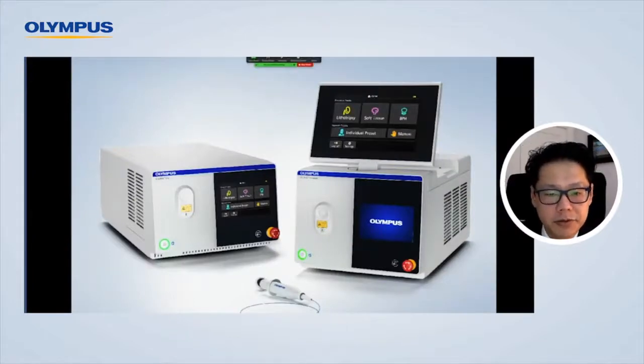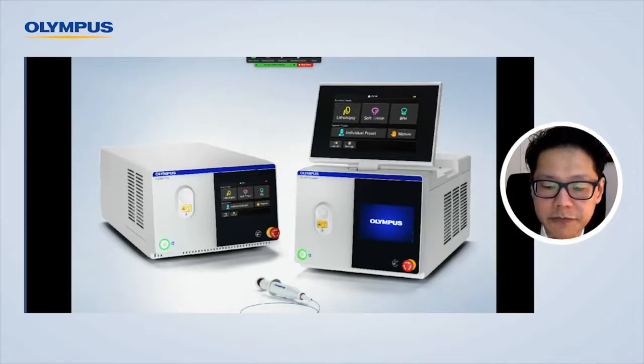These are the two models that are available. This is the Pro model and this is the Premium model. And this is the model that we have. This one has a nice touchscreen and it goes up to 2400 Hertz. This one goes up to 4 joules and 100 Hertz, whereas this one goes up to 6 joules. So I just want to show you a few things here.